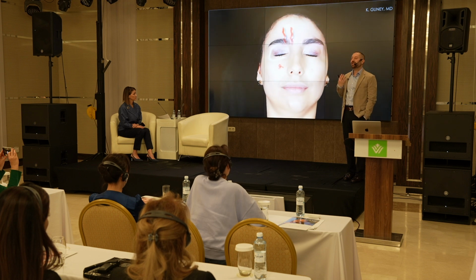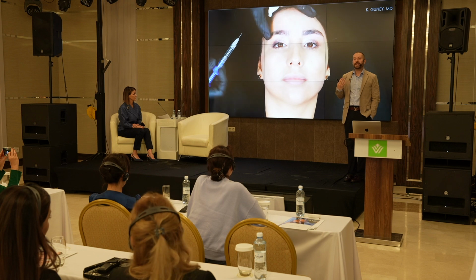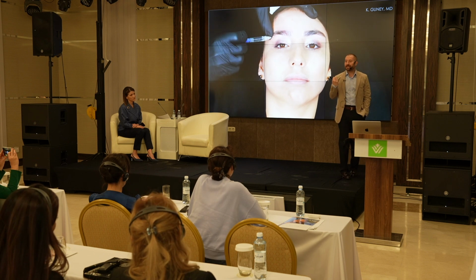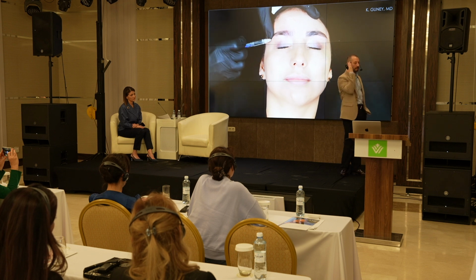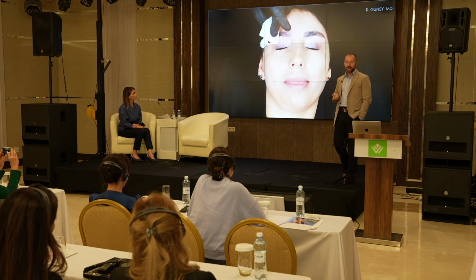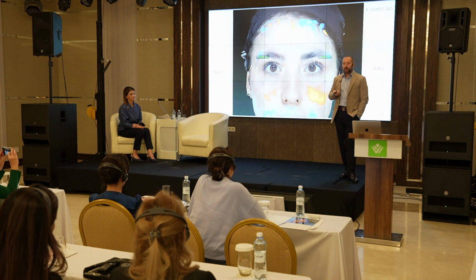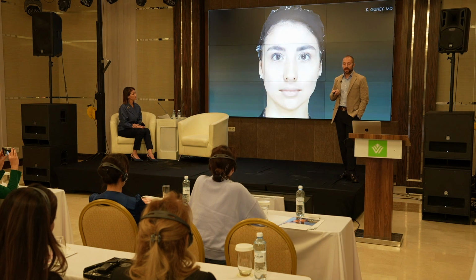And you cannot inject too much volume because you elevate the eyebrow, but this is also a gel. It's 3D volume. So from the profile, your eyebrow comes a little bit forward. Okay, you cannot inject too much, so it's unnatural looking. So 0.3 each side of RH2 injections. You can see the difference, the elevation, the lateral part of the eyebrows.